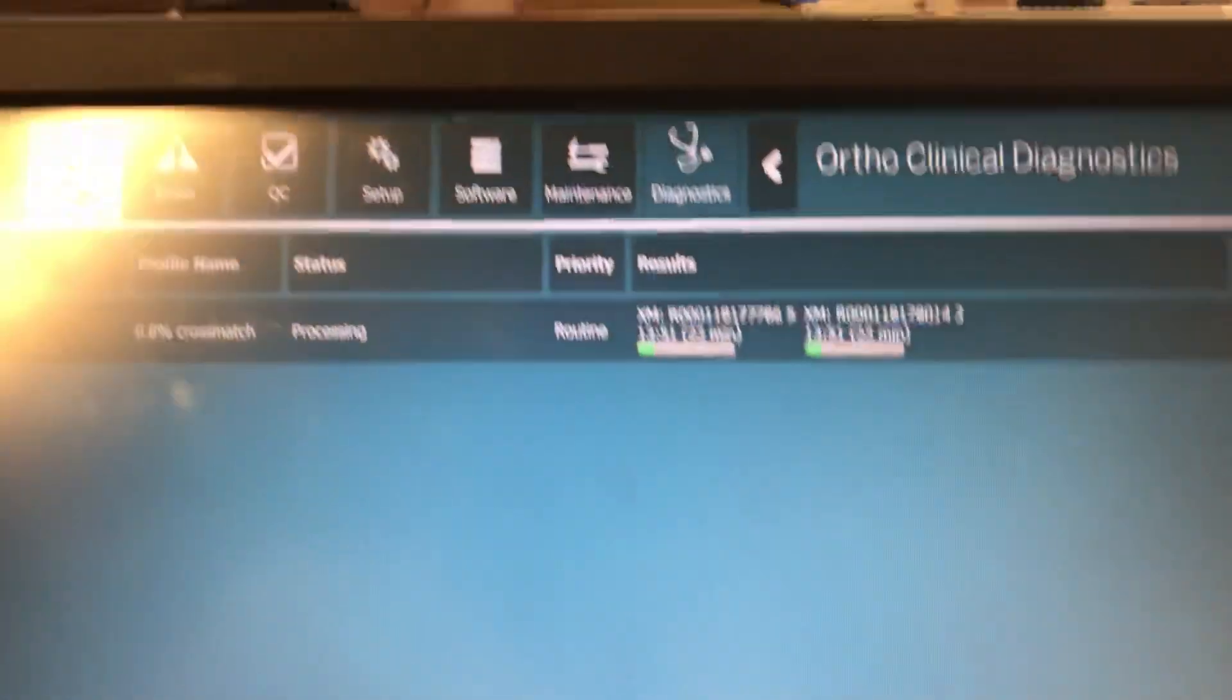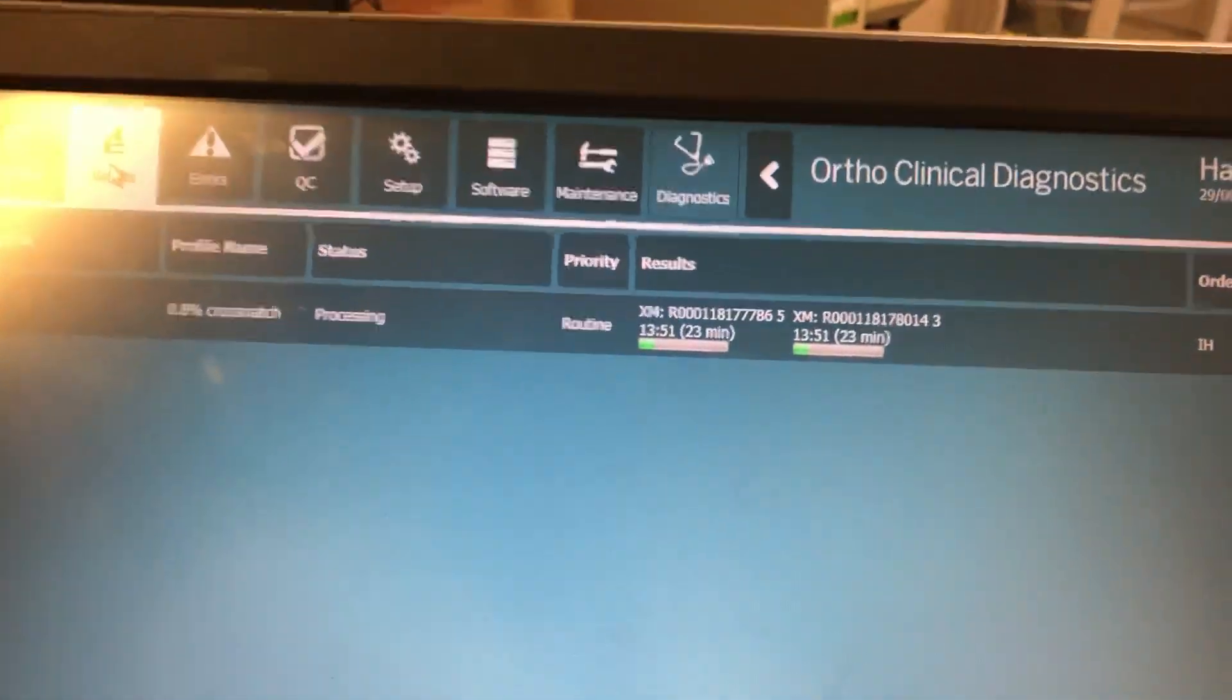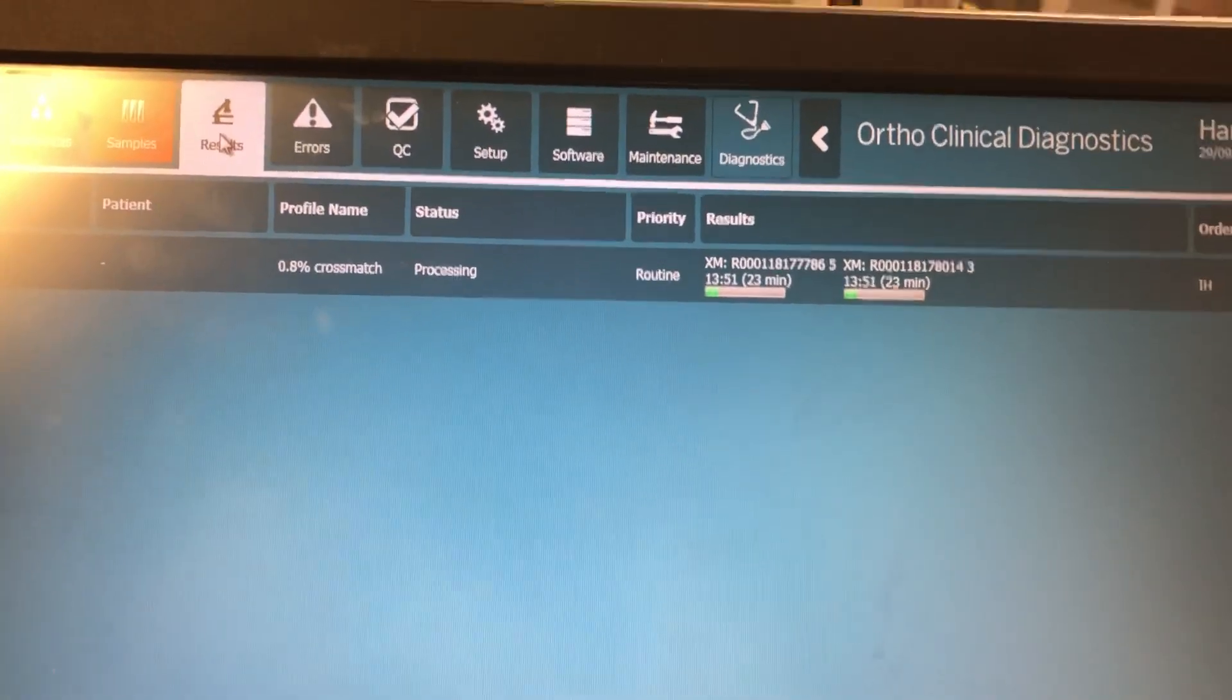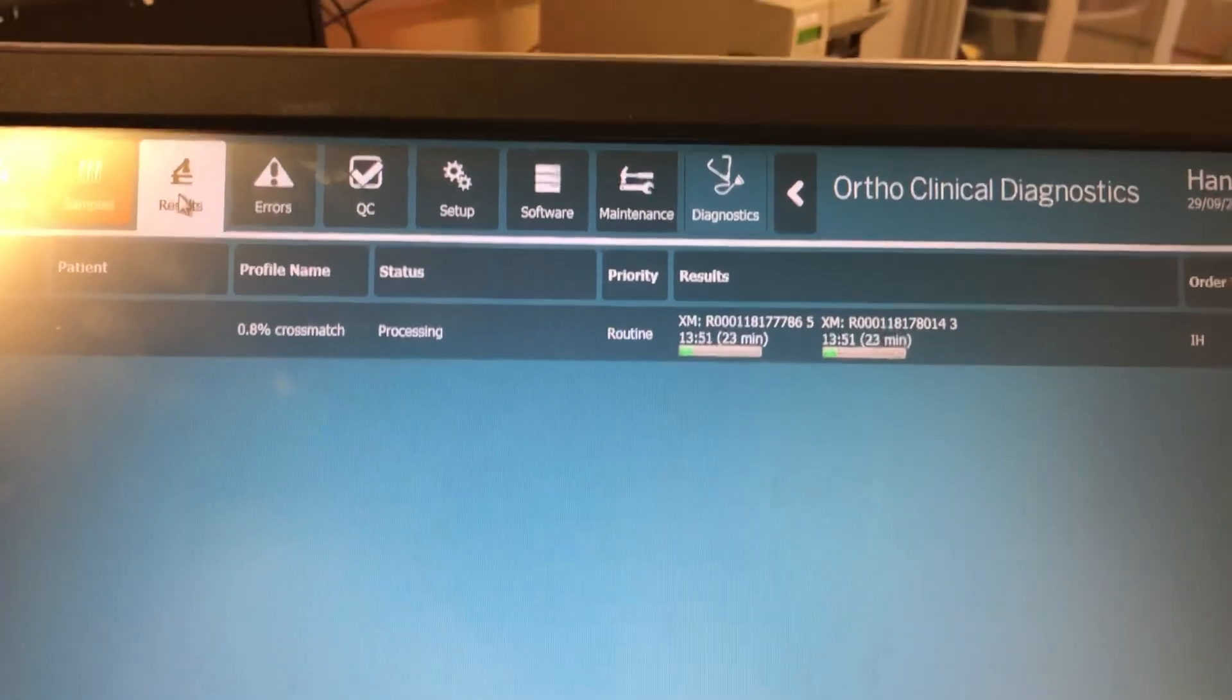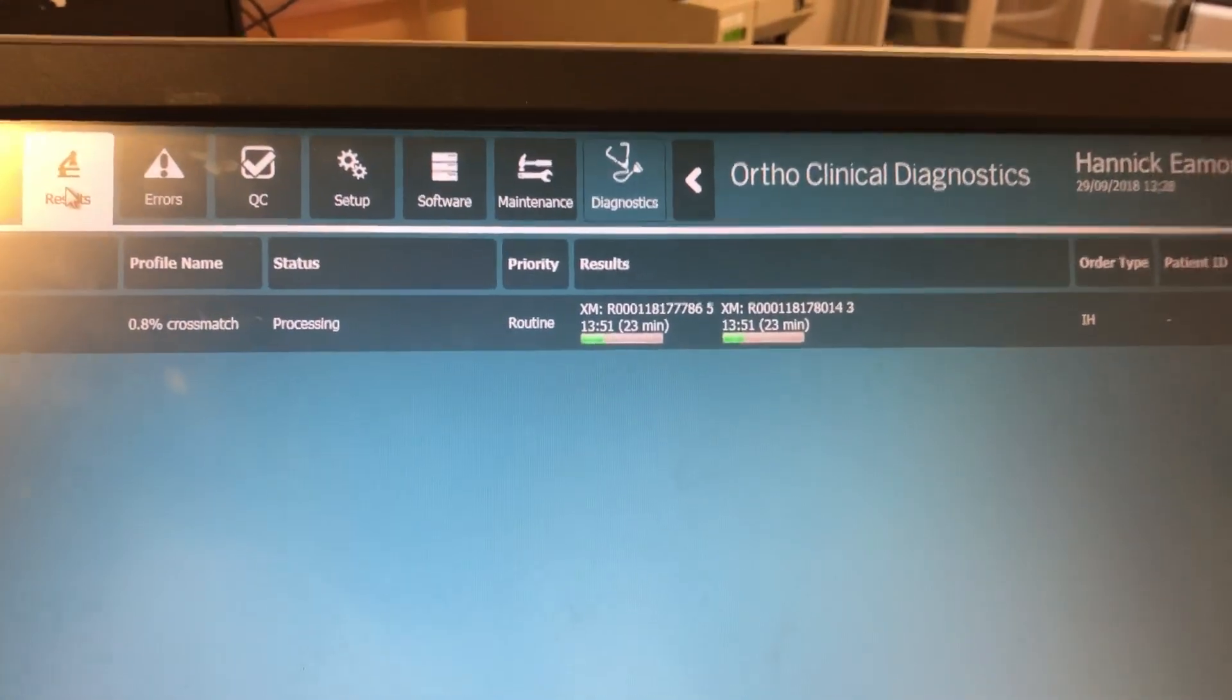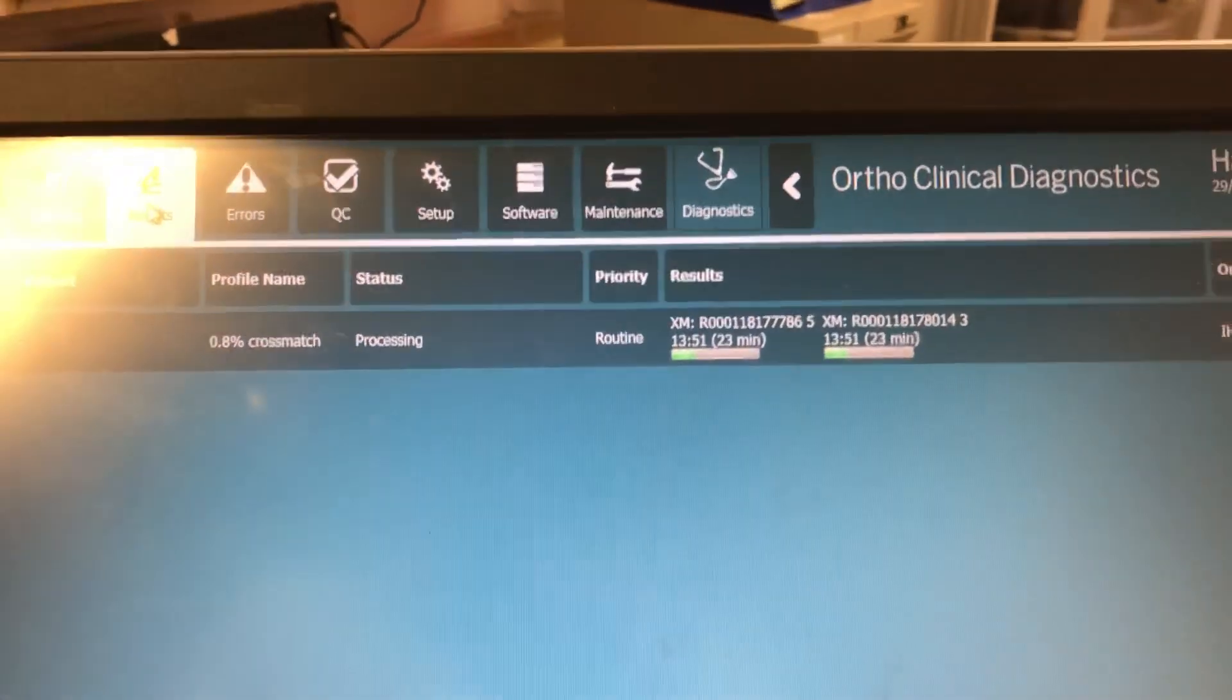And if we go into the results here you see that the request has been made. Okay, so that concludes the tutorial on how to manually order a cross match on the vision workstation. Thank you.